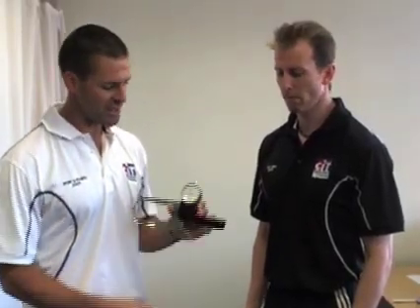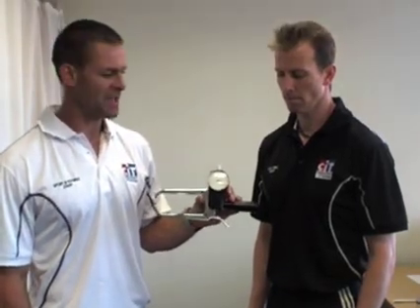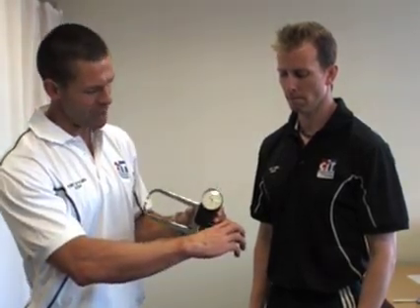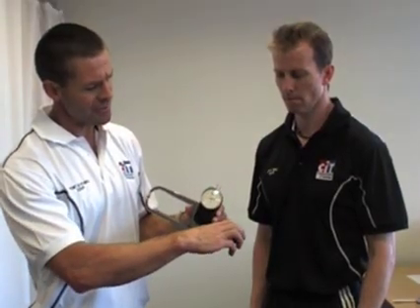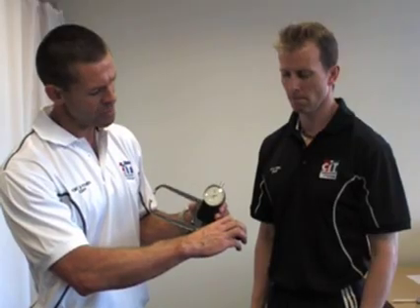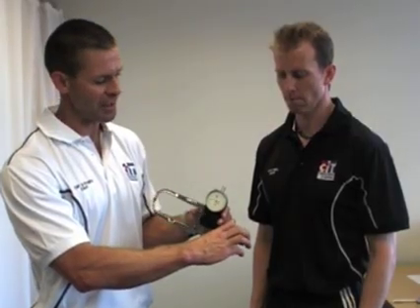We use these particular skinfold calipers here at CIT. These are the better brand of skinfold calipers and they work on the basis that as you open up the calipers wider, the needle on the display moves around and the thickness of the skinfold is measured in millimetres. Once it does one loop, that's 20mm, and it increases by 20mm for every rotation.